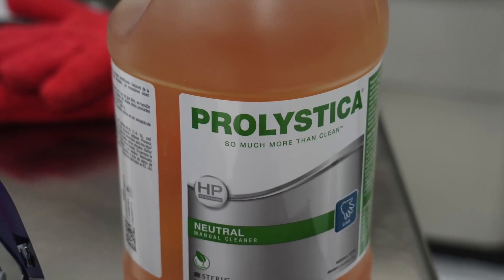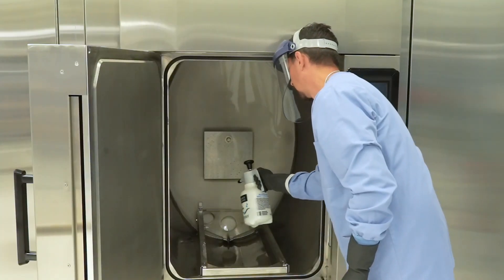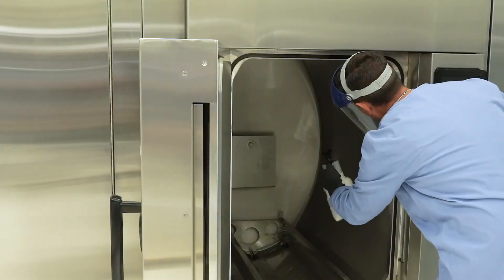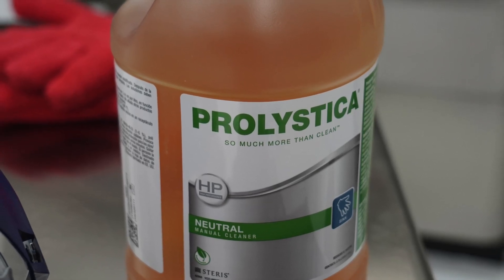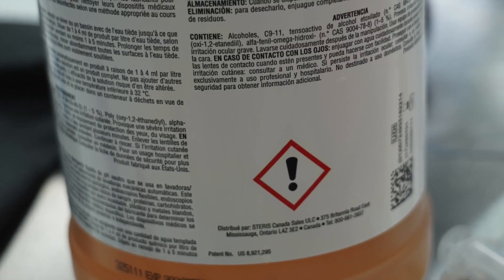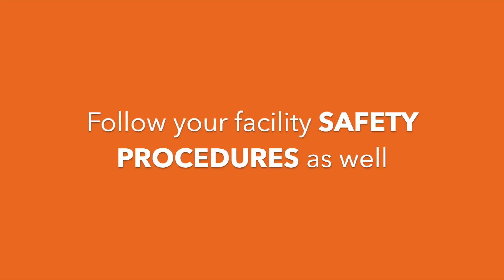When spraying the diluted Prolistica HP Neutral Manual Cleaner into the sterilizer, use a coarse sprayer that does not produce a fine mist. Prior to using Prolistica HP Neutral Manual Cleaner, review all warnings and precautions on the product label. In addition to the safety considerations outlined in this document, follow all safety protocols outlined within your facility's safety procedures.